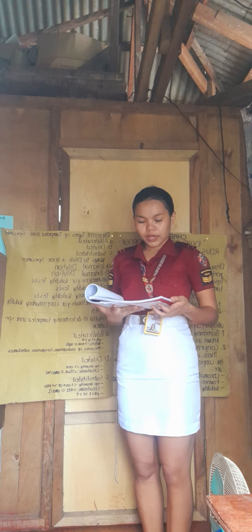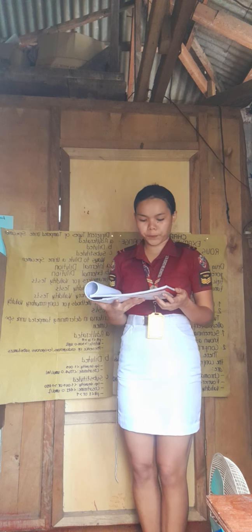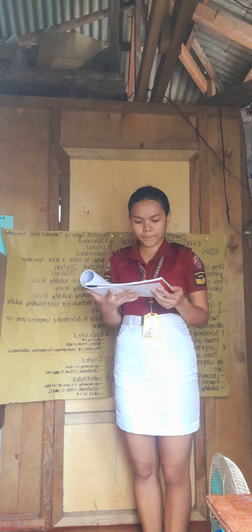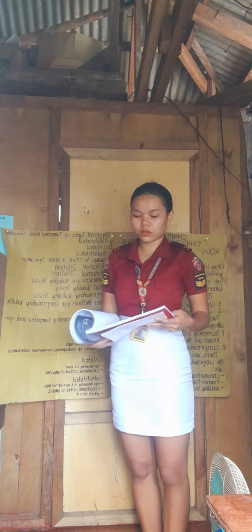So, second is diluted. It refers to a specimen with less than normal physiological constituents. Third is substituted. A specimen which has been derived through switching or replacement of the original sample.